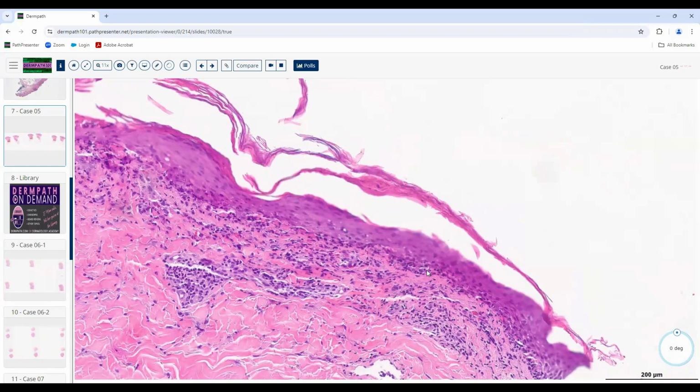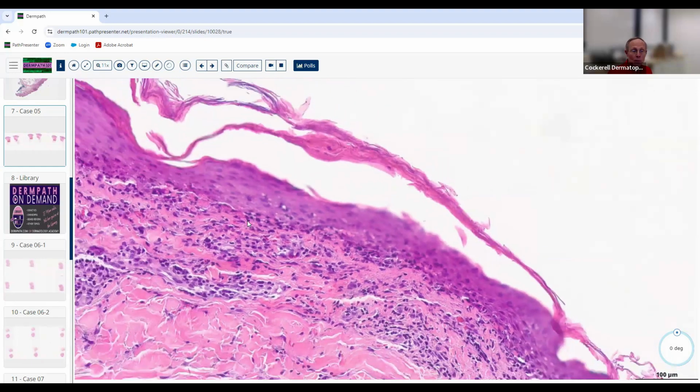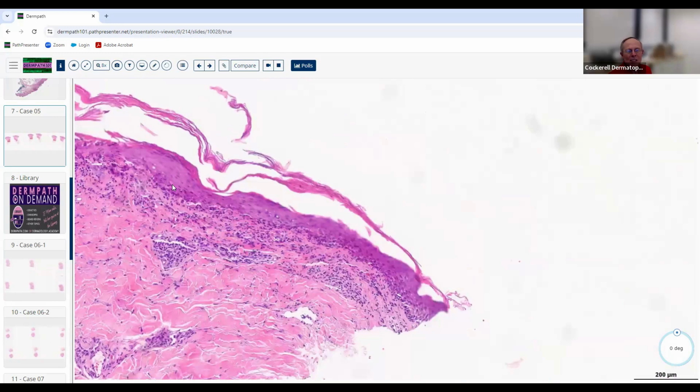Drug eruption. So this is actually one of the most common patterns of a drug eruption. An interface dermatitis like this with dyskeratotic keratinocytes. They've got this widespread, scaly, sometimes more morbilliform eruption. You biopsy it, and it looks very much like this. Now, they're not going to show you this and say, what's the diagnosis? But they might show you this and put 3 or 4 things down in the differential diagnosis and expect you to kind of figure it out.